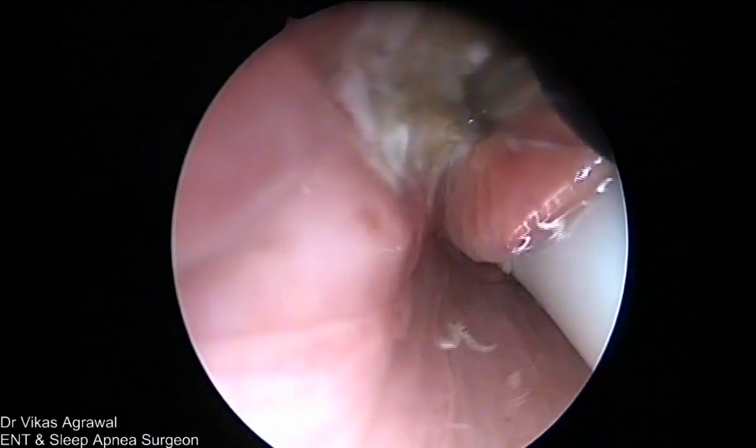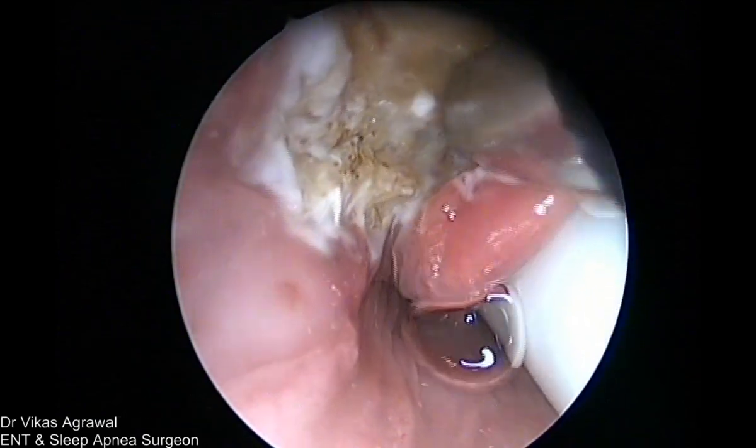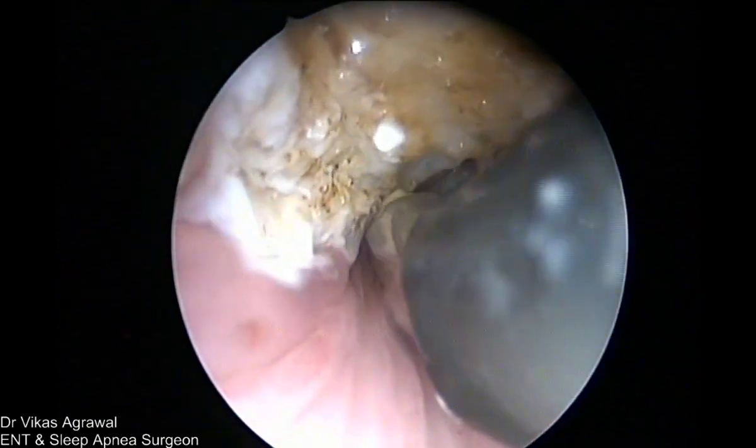And you have to coagulate right till the median glossoepiglottic ligament. Can you see that? Yeah. See, then only there will be good fibrosis happening.